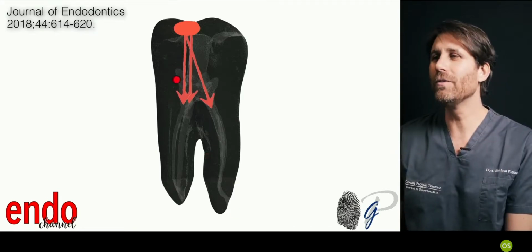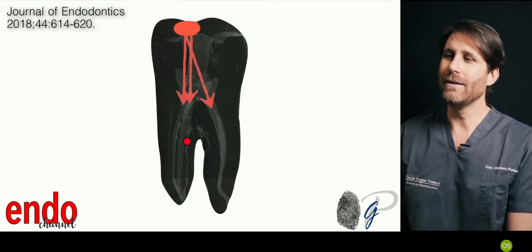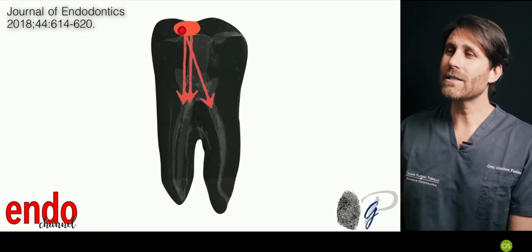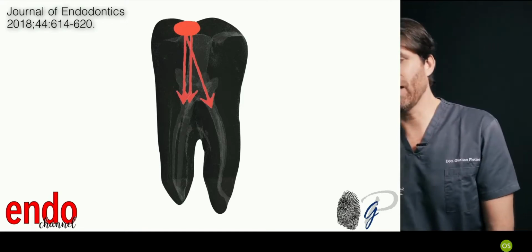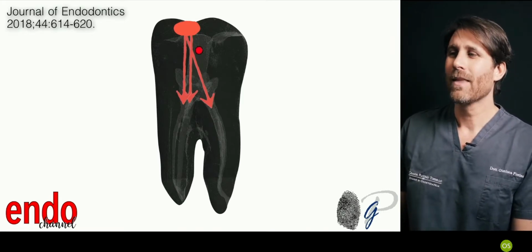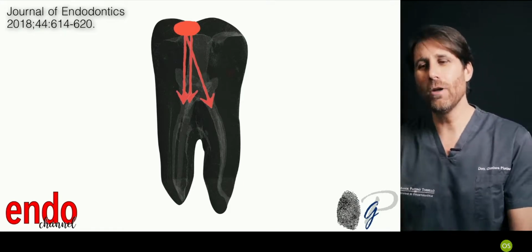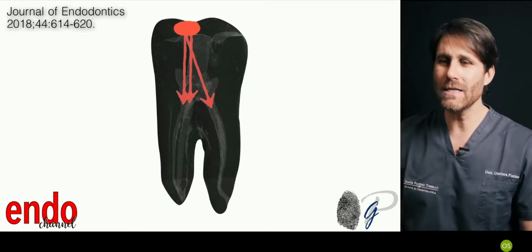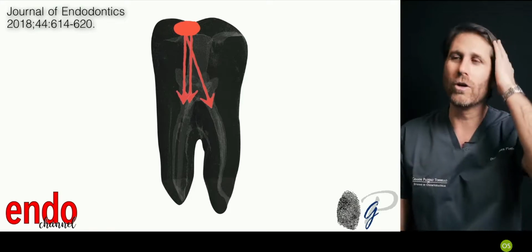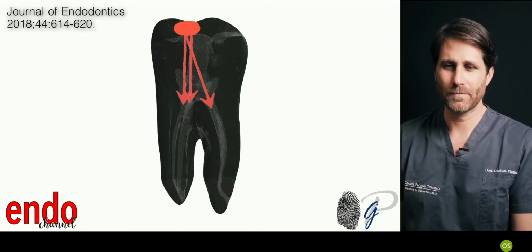So if we have to remove the soffit here, it's good to move the orifice on the mesial aspect, because the distal canal or canals have an orifice directed entrance towards the mesial aspect of the occlusal surface, and we can save very much dentin in the distal aspect and the soffit in the distal aspect to increase the fracture strength of the lower molar. So this is the approach that I follow in molars, that is the more difficult, and you have seen also in the premolars extending a little bit in the buccal and palatal direction.